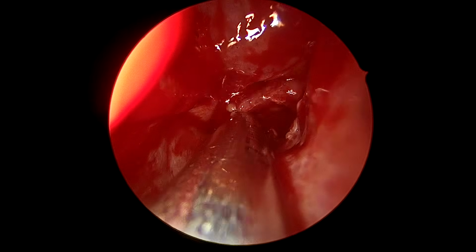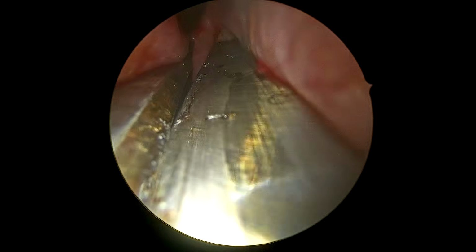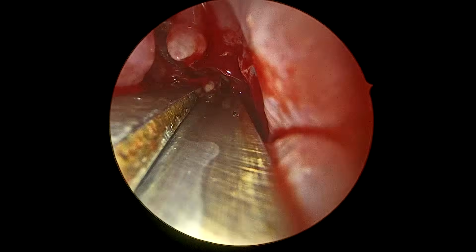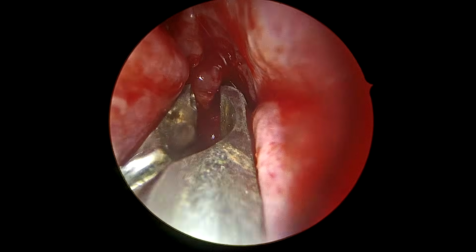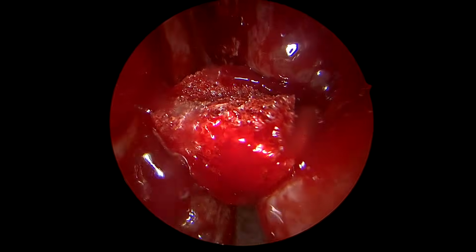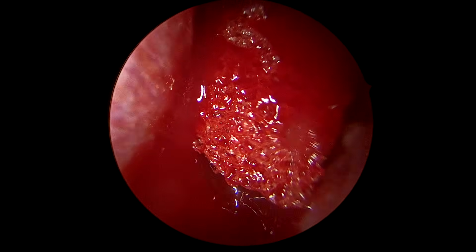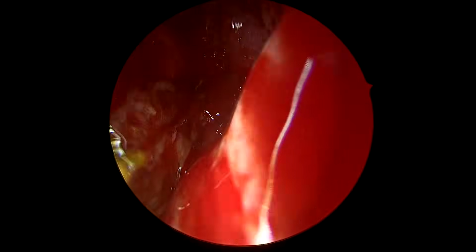At this point, you can see the mass is slightly going towards the maxillary sinus, which I am debriding right now. My first step would be to enter the maxillary sinus. What I have done is removal of the middle turbinate. I removed a portion of the middle turbinate just to have access so that I can see the attachment of the mass clearly, and without damaging the normal structures I can take it out completely, leaving no chance for any recurrence.